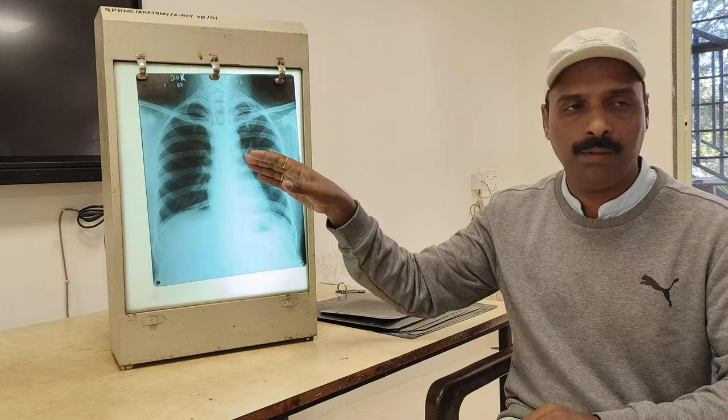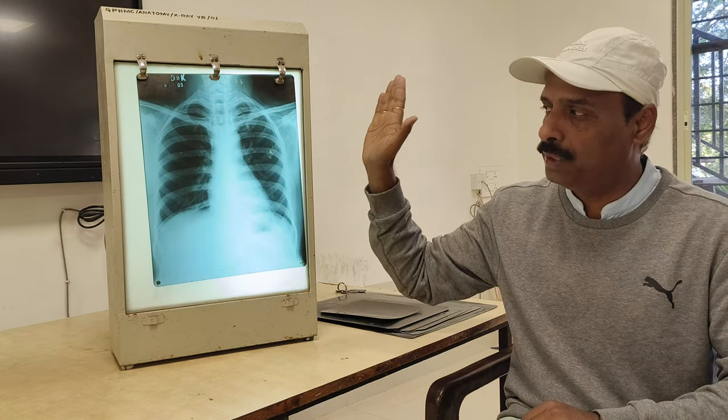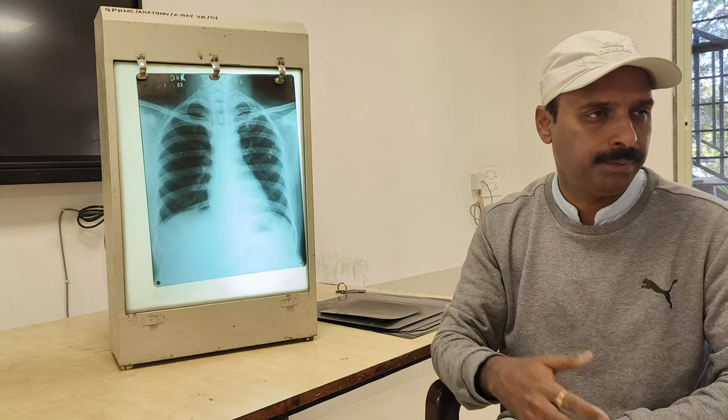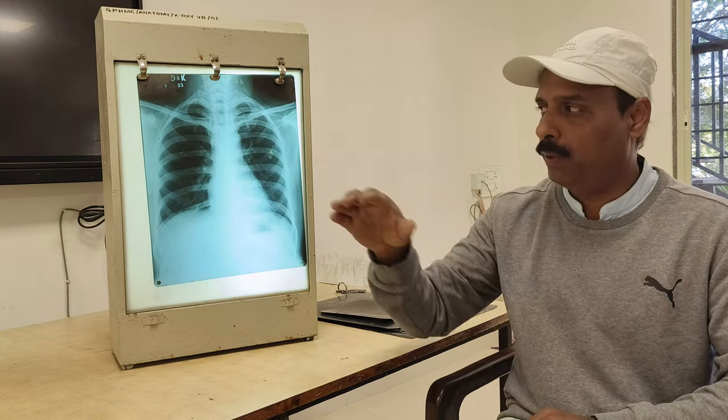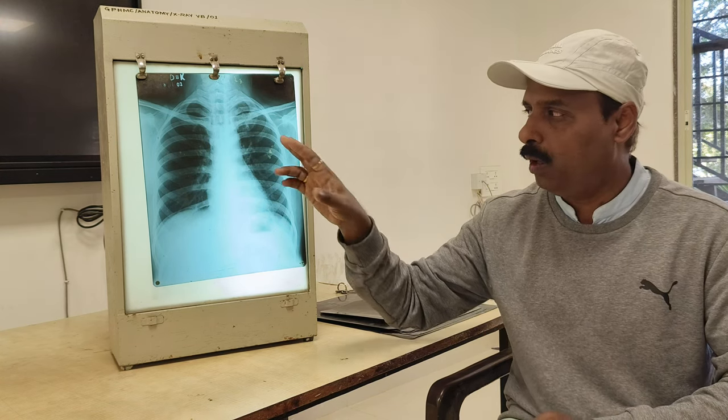Then in the plain x-ray we also have AP, from front to back. Then we take the lateral view. So in the plain x-ray we take two or three types of views: PA view, AP view and lateral. So you know the anterior posterior, AP, posterior anterior, PA, then the lateral view. All of these you have to remember in the plain x-ray.